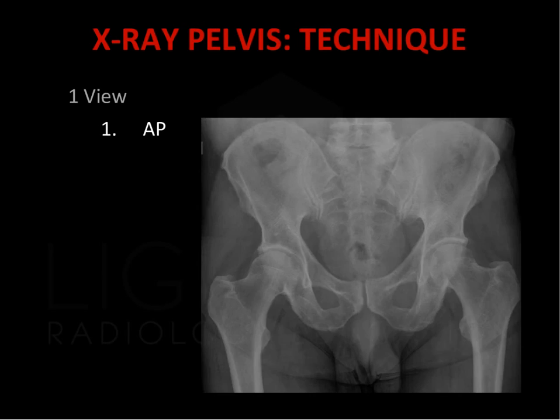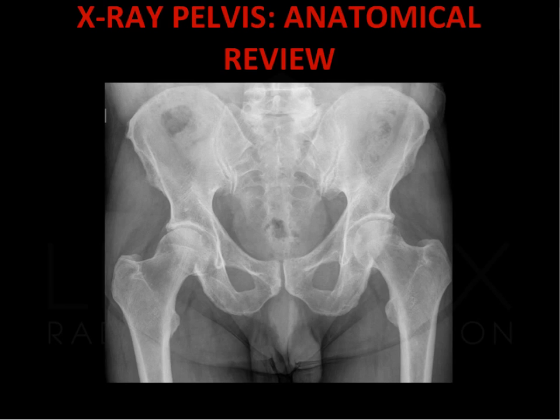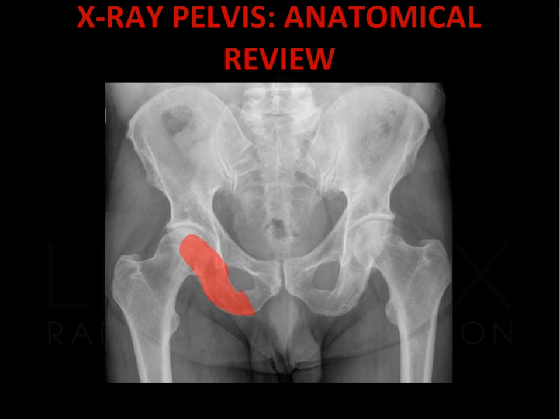The standard projection is an AP radiograph. The bony pelvis consists of the sacrum and coccyx. This articulates with the iliac bone via the sacroiliac joints. The pubic bones articulate with each other at the pubic symphysis. The ischial bones fuse with the iliac and pubic bones to form the acetabulum.